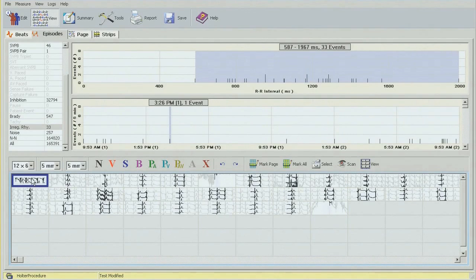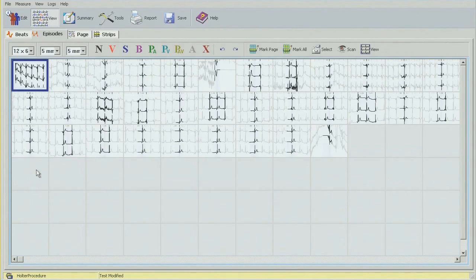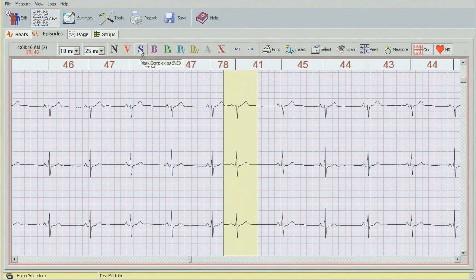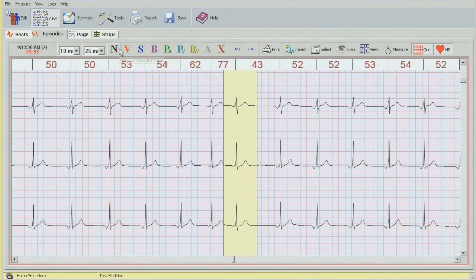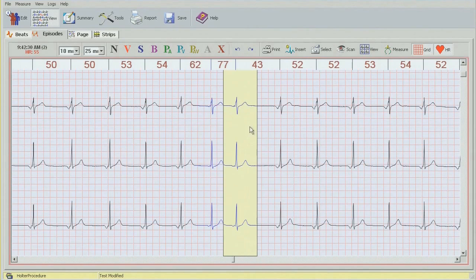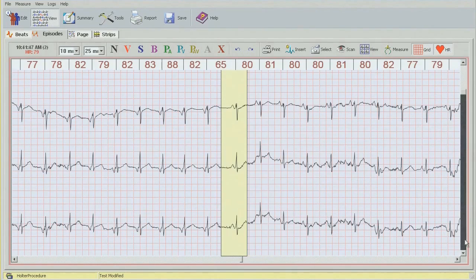Irregular rhythm — 33 episodes. Click on any box and use the Z button. There are supraventricular beats — one, two, three, four — probably just four. I'll change them to supraventricular by double-clicking to go to full disclosure and change this one. That's sinus arrhythmia; there's our supraventricular beat — another one, and this one is actually a couplet. The P waves are a little different, so I'll label those two at the same time by pressing the Shift button and clicking on the second beat, which highlights both, then change them to supraventricular. That's pretty much it.